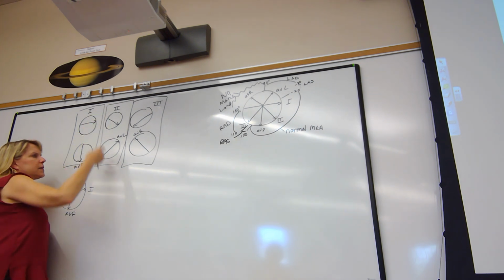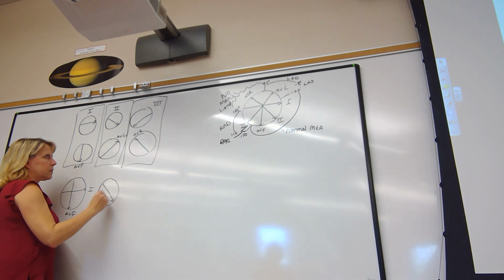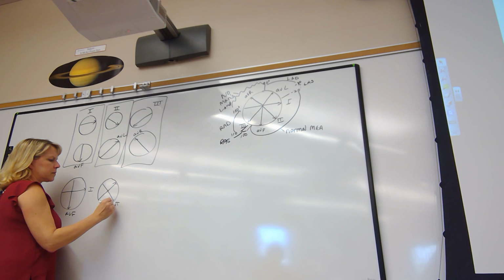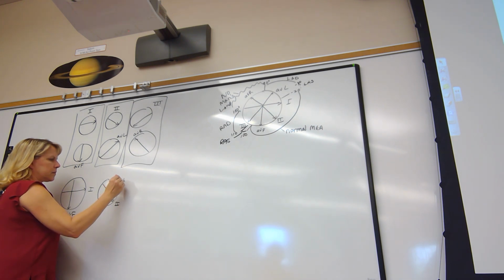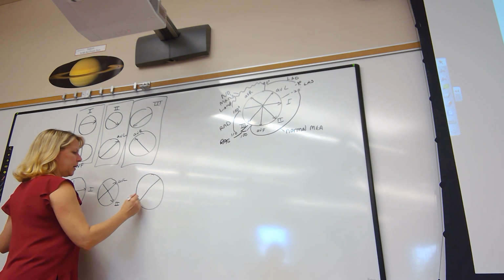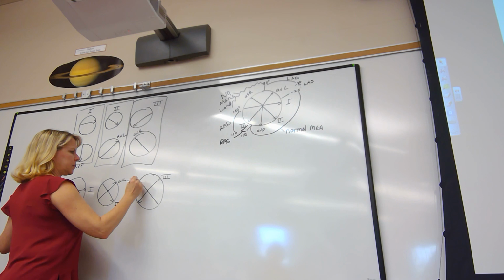If I do this for the next set, I get lead 2 and AVL. And the last one, I get lead 3 and AVR.